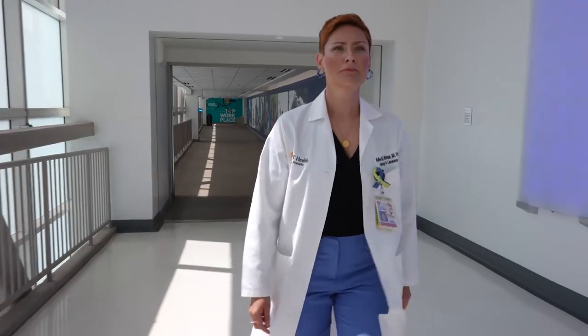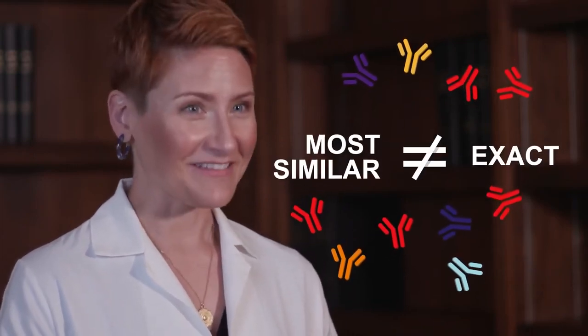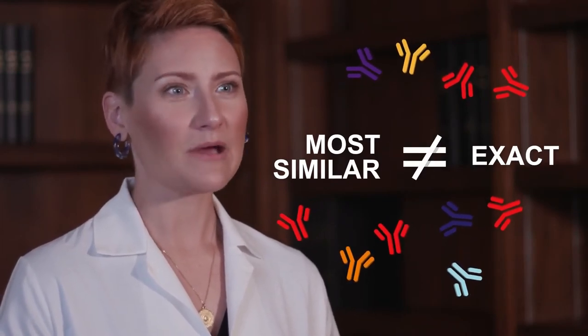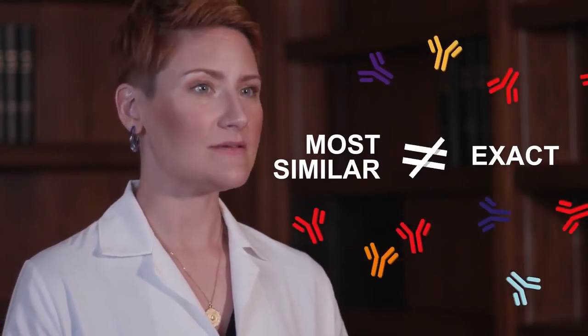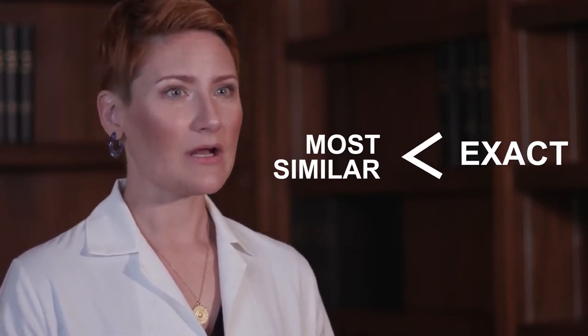When we are looking to fill those gaps without reagents, we can analyze the data to see what we have on a base panel that's the most similar antigen on the panel. But it's not exactly the antigen. It's just antibody reactivity that may be similar. So it's an option, but it's not the most accurate option. We would much rather be able to characterize specifically the potential for antibody reactivity against a specific antigen.